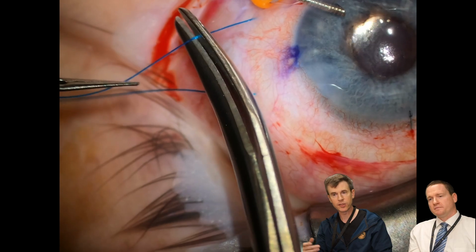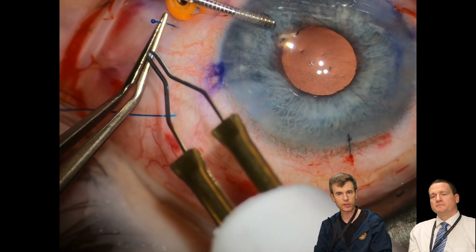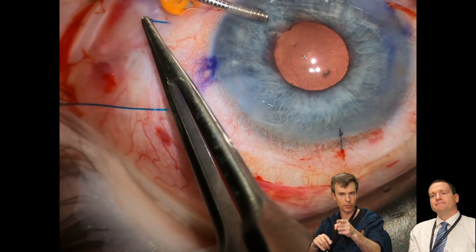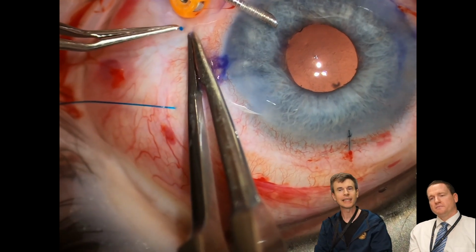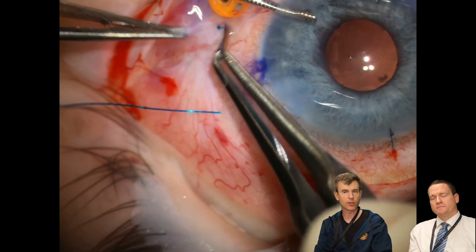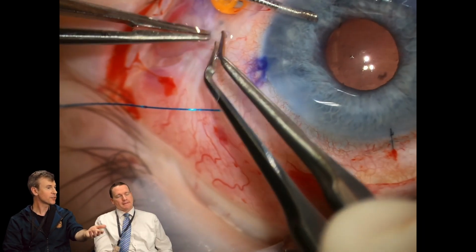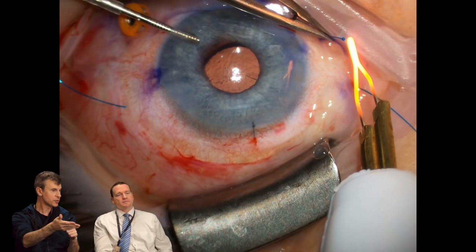The other traditional lenses, some have eyelets, sometimes it's looped around. There are whole books written on scleral fixation. This is called a riveting technique because you create this little bulb at the end that then will prevent the suture from sliding into the eye. And you can do this even if you have a lot of conjunctival scarring, like in this case. I remember this patient actually had retinal surgery, so you see all this scarring. The conjunctiva is not very loose at all. So that's probably the reason why the lens dislocated.